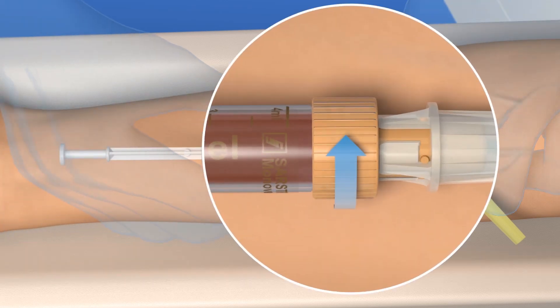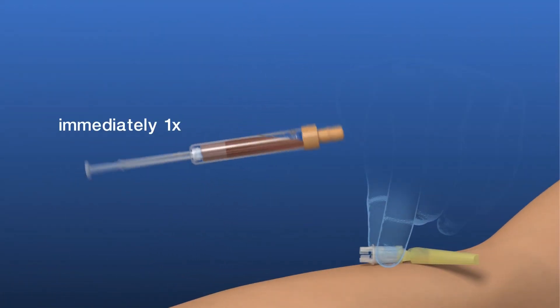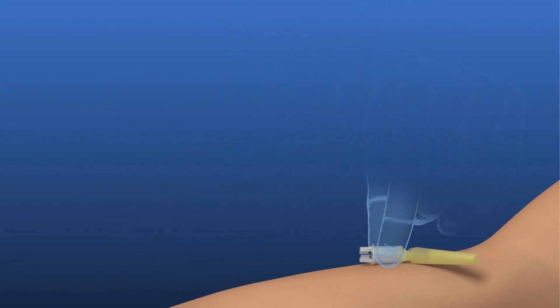Rotate the filled S-Monovette anticlockwise to remove it from the safety needle. The safety needle will remain in the vein. Now invert the S-Monovette once and store it in an upright position.